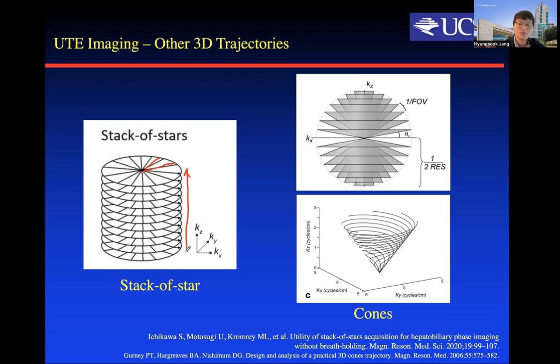So we use a phase encoding scheme in this direction. So the scan time is much shorter, and it is also less affected by eddy current, because phase encoding is robust to eddy current.